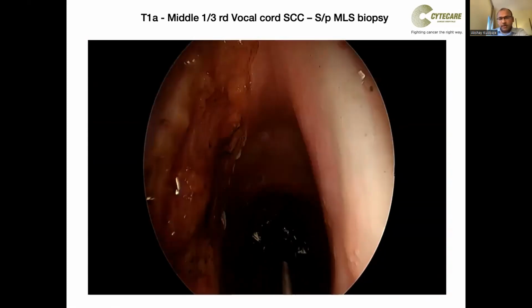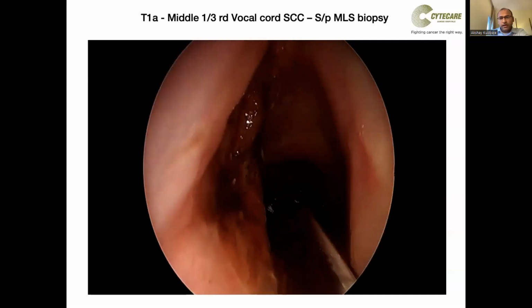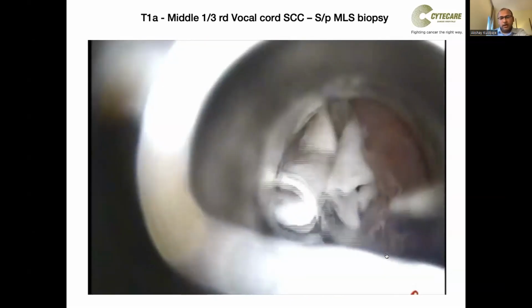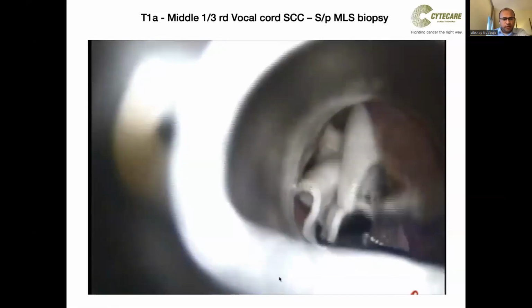Post resection, sometimes there may be a bit of charring in the operated bed. So we use a wet neuropatty to remove the carbon particles to reduce granulation formation, thereby having better healing and better voice outcomes.